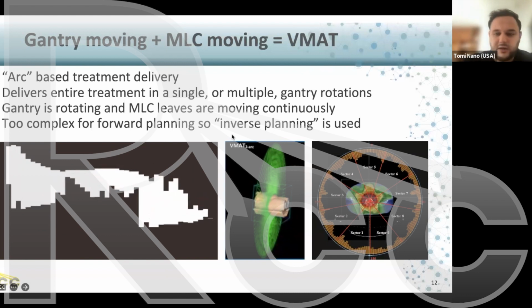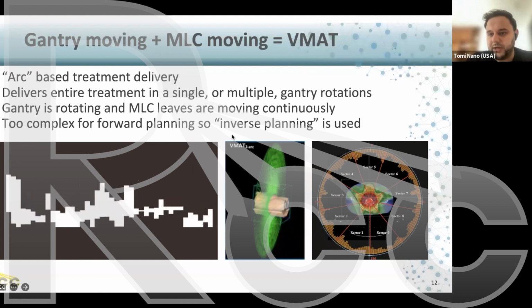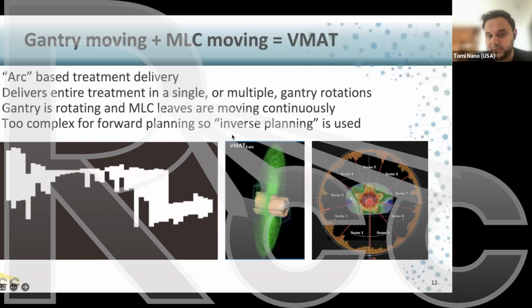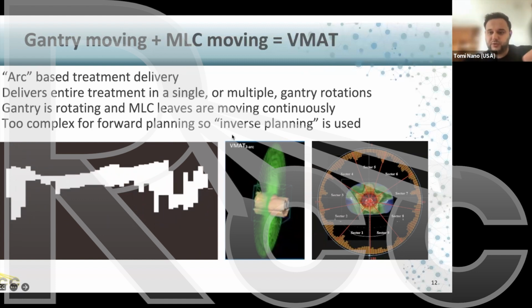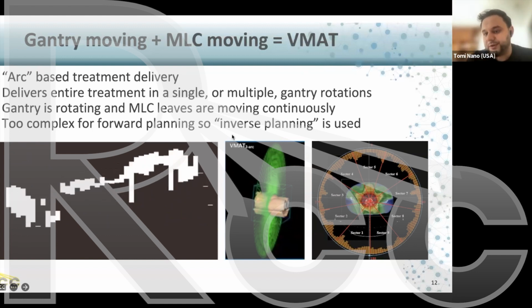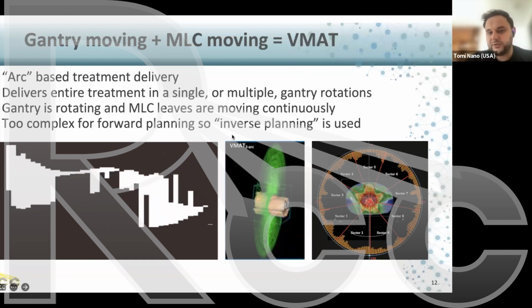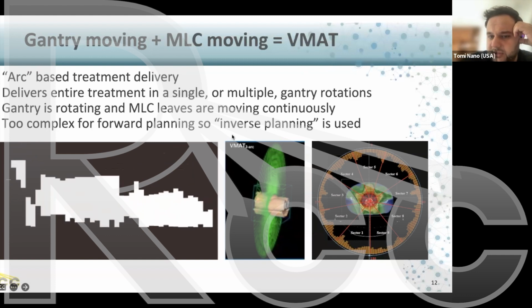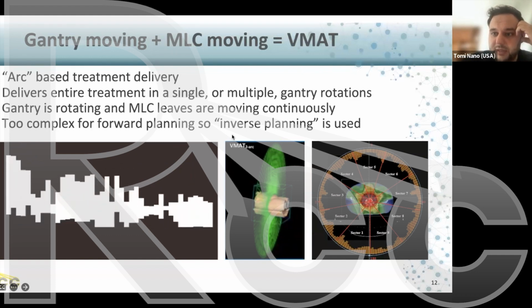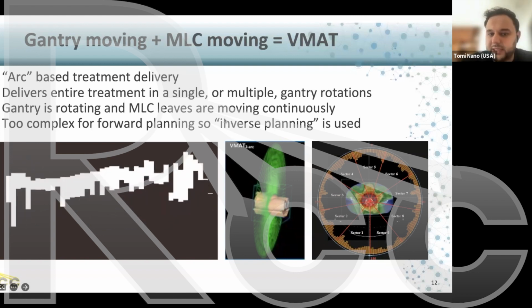I know Sun Nuclear software has this flip capability where you can measure one part of the plan with your detector and then flip the detector, so you rotate it to measure the other part, and then the software will stitch them together based on your setup and give you a full dose plan. If I understand correctly, something like that is done regularly. But that's a good question for the patient-specific QA module, and I'm sure they're going to go into more detail. That's a great question.